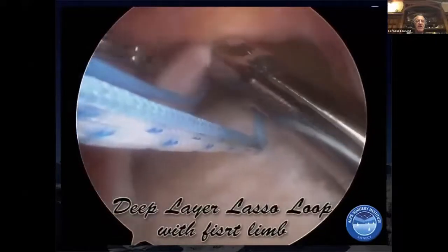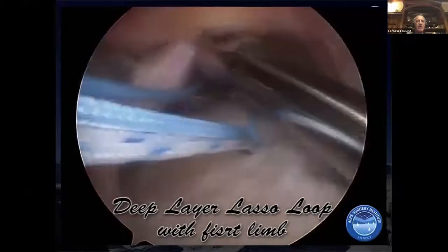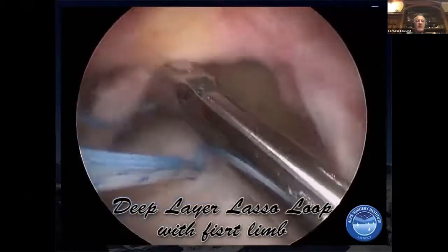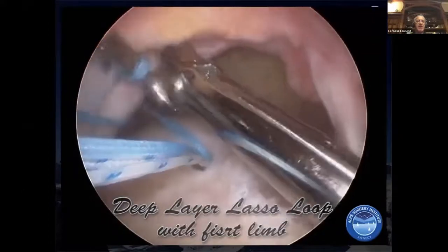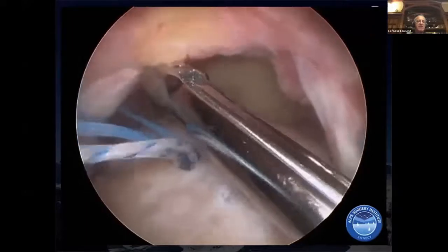So as they have a different insertion location, you should restore the anatomy by doing a different repair for both layers. So what I want to do is repair the deep layer first with this lasso loop technique here. And you see that this deep layer has been repaired with the lasso.